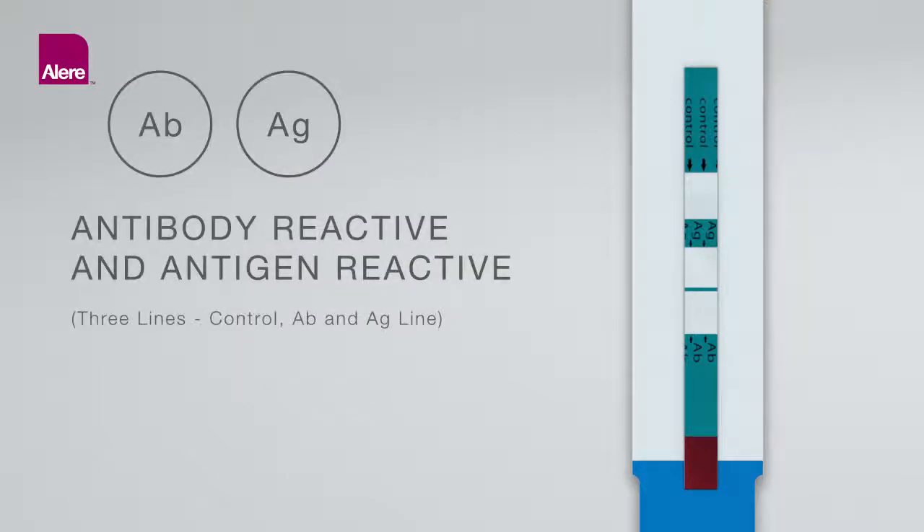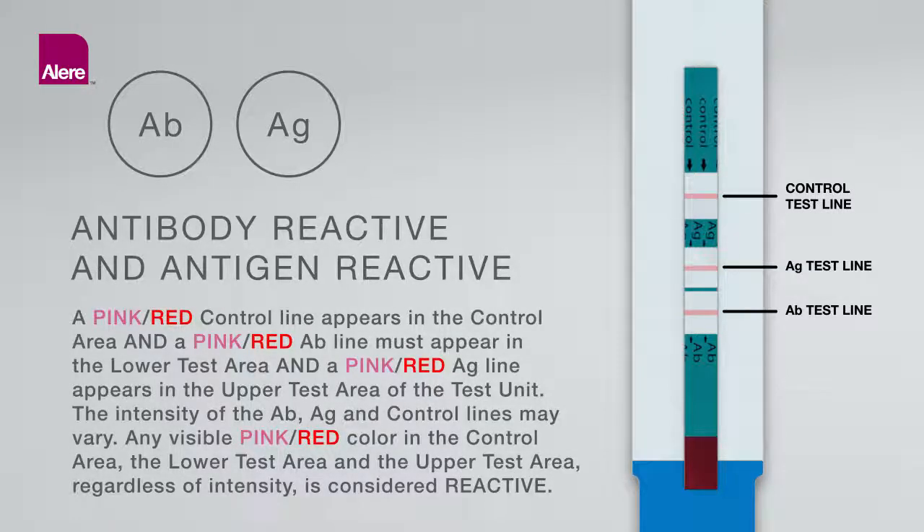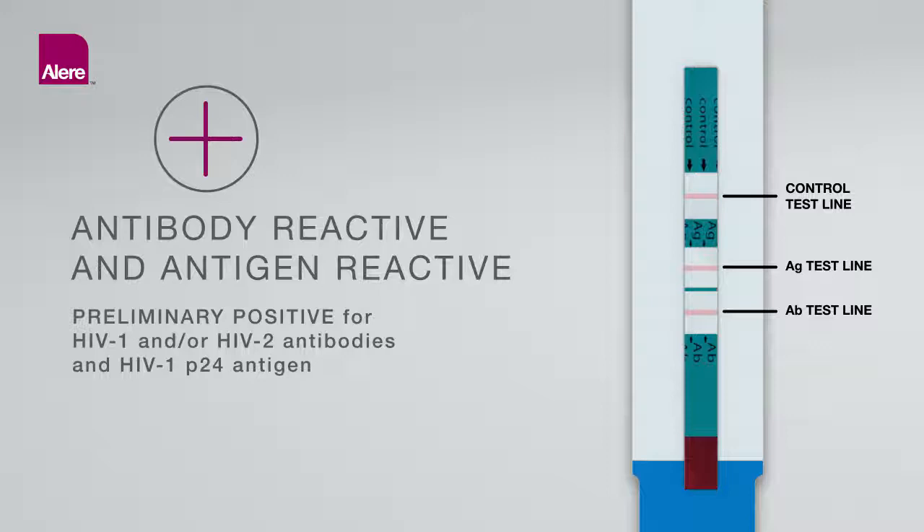Antibody and Antigen Reactive (Three lines: control, antibody, and antigen line): A pink-red control line appears in the control area, a pink-red antibody line appears in the lower test area, and a pink-red antigen line appears in the upper test area of the test unit. The intensity of the antibody, antigen, and control lines may vary. Any visible pink-red color in the control area, lower test area, and upper test area, regardless of intensity, is considered reactive. The test result is interpreted as preliminary positive for HIV-1 and/or HIV-2 antibodies and HIV-1 P24 antigen.